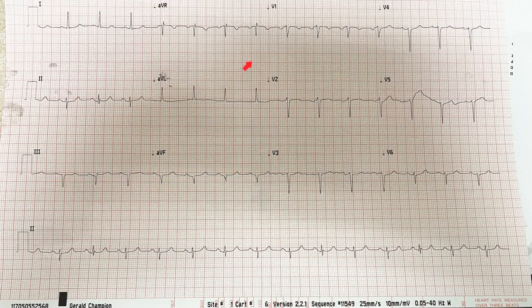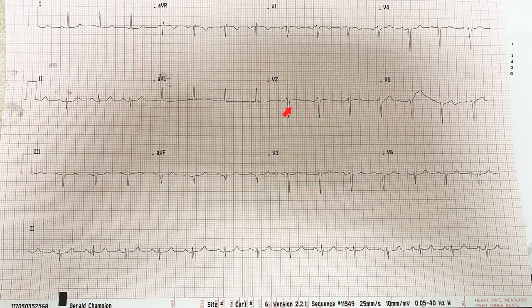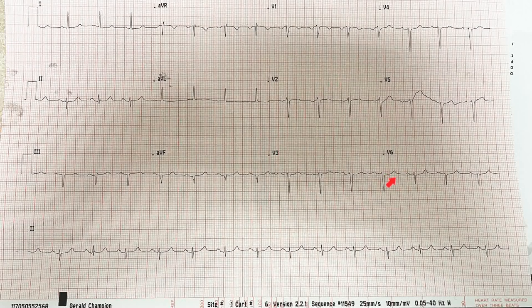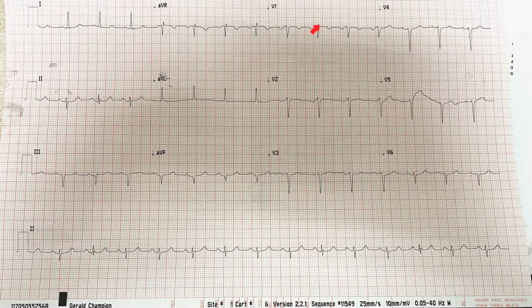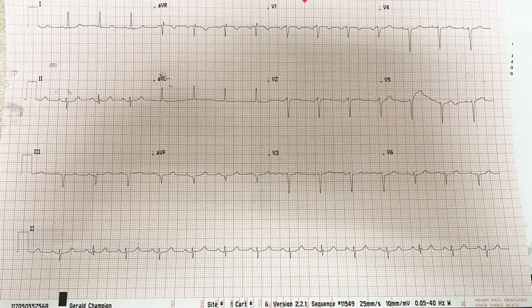After that I look at R wave progression. The QRS usually switches from negative to positive around V3, but here it's still negative at V3, still negative at V4, still negative even at V6. So there is very poor, if any, R wave progression. In my mind I ask why — and I know why: because there is a left anterior hemifascicular block, which we already diagnosed as left axis deviation with negative lead 2. That explains the poor R wave progression. I also check for any prominent R wave in V1 and AVR, which would indicate right ventricular strain or hypertrophy.